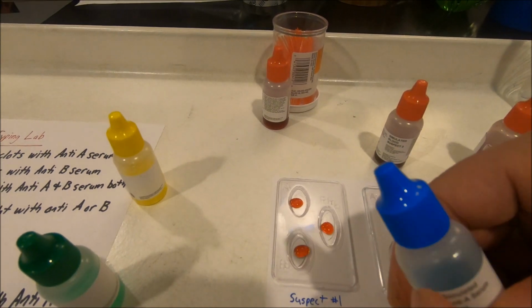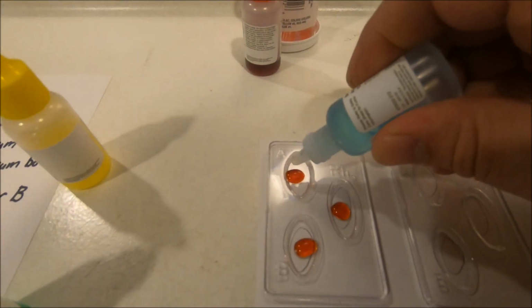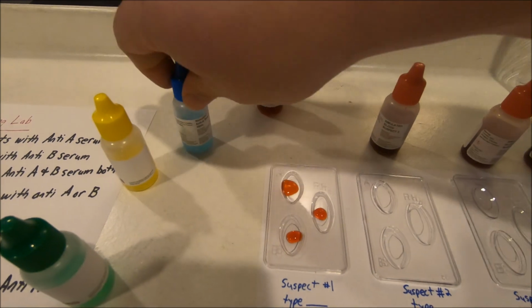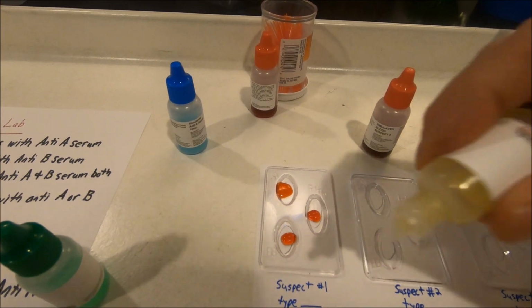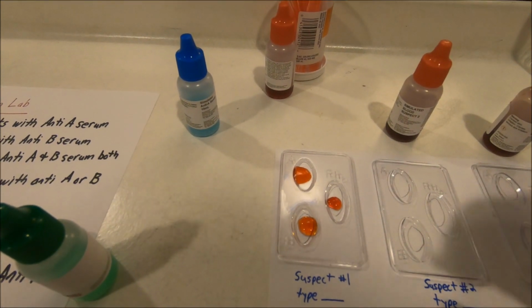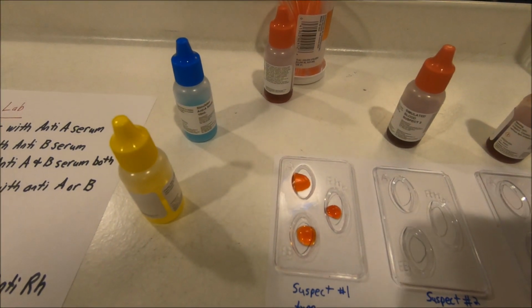The anti-A serum is going to be put into the first slot. The anti-B serum will be placed in the lower slot. And the RH serum will be placed into that third slot.